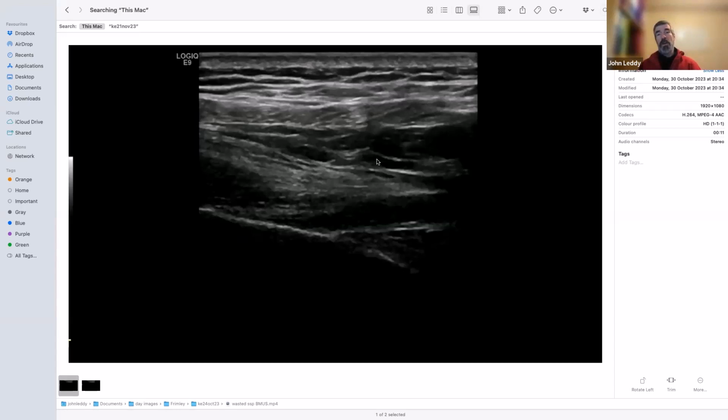In fat, you often can't. But there'll usually be a muscle next to it, and you'll go, well, that's really muscle because it does that, and I can't get that for that other area, so it's going to be fat until proved otherwise.